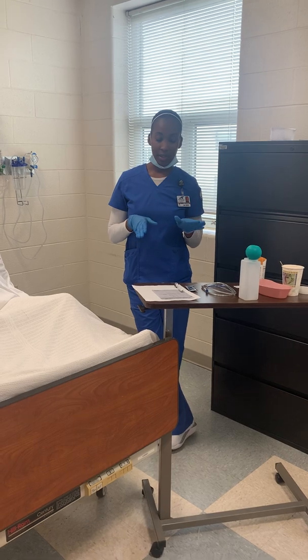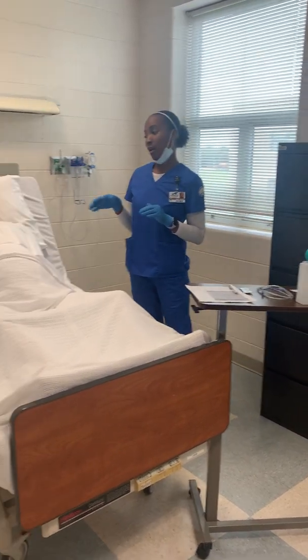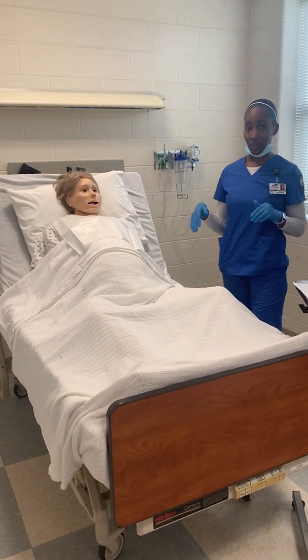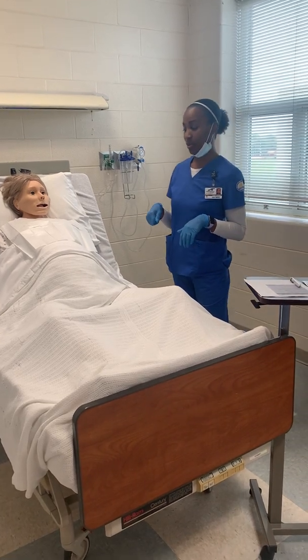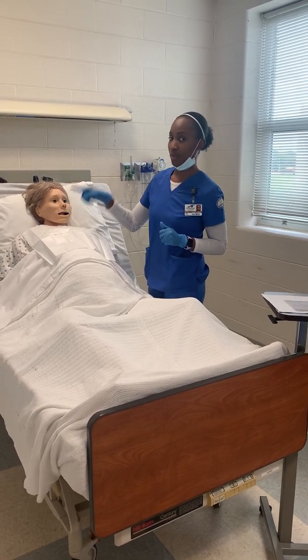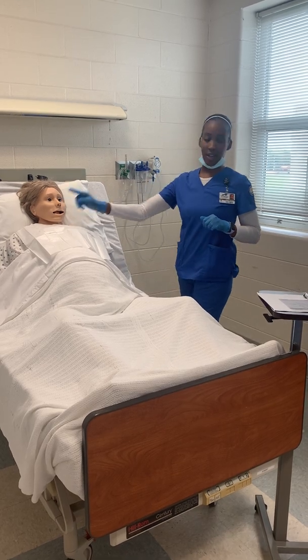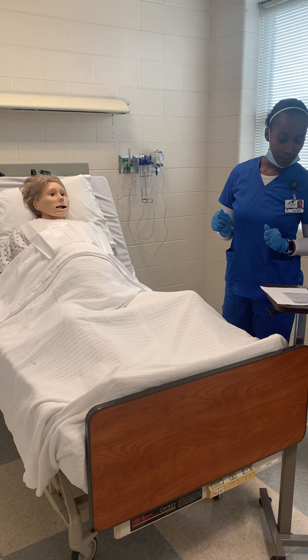So, the first thing I would do for my NG is assess, do a full focused abdominal assessment. I will also want to assess the nares to see which one is more patent. You can touch your finger to a nostril. So we're going to use this nare right here. Poked her, but she's alright.